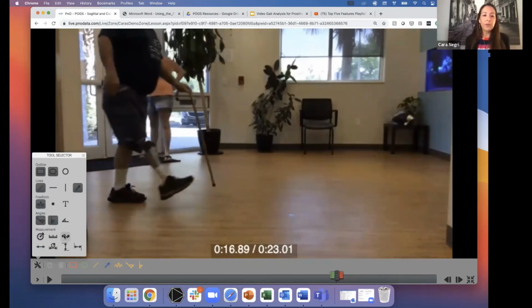This is also another tool that I use to talk with my patients about what I'm seeing with their gait. Obviously you can talk with them about any lateral leaning that you see, and you can practice some strengthening, and you can go through what you're seeing. It's nice to show them, okay, here's your lateral trunk lean, show them where that line is, so that maybe they could practice a little bit and then take another video and see if they've improved. Those are really great things to do to help them visualize it.